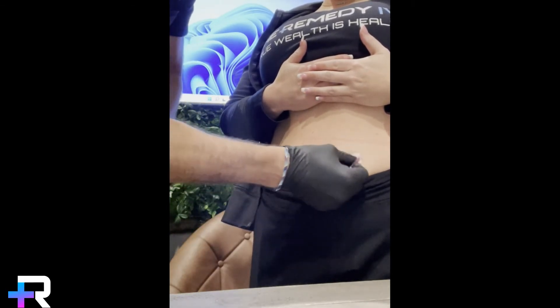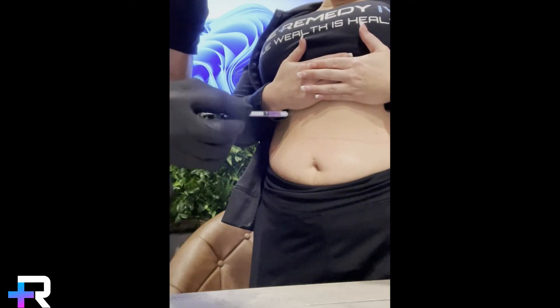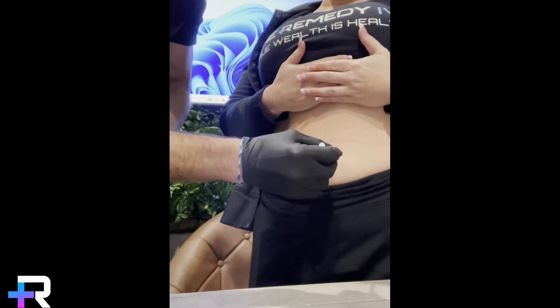You don't need to worry about pinching anything. The needle is so small that you can just go straight in. So you'll swab a little part of the belly with the alcohol swab, and then the injection needle — just go straight in, perpendicular to the skin.